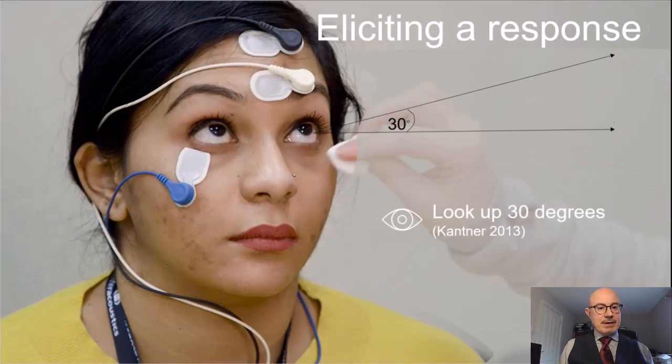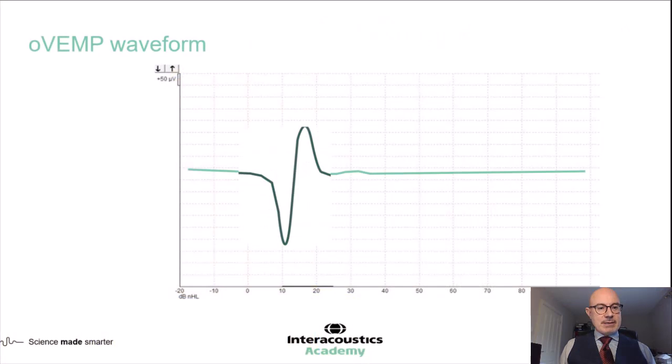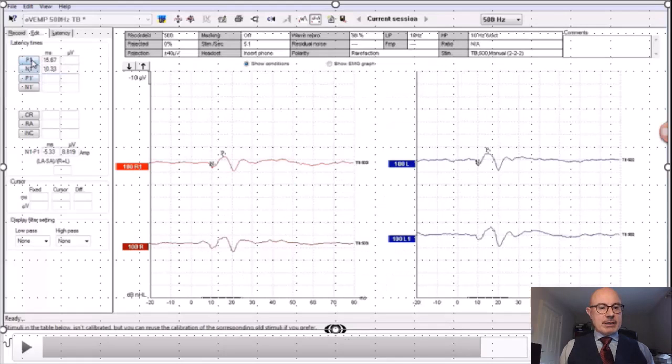To get the ocular VEMP response, we do need to elevate the eye. We're not turning the muscle as we do in the cervical, we're actually raising the eye, and again I'll deep dive into this a bit later for you. What does it look like? Well, typically what you're going to see is a response where we now have a negative and a positive peak, because it's an excitatory response, not inhibitory like the cVEMP, an excitatory response where the muscle's actually going to jump and then recontract again. And on the Eclipse, we'll be looking at something that has a morphology such as this.